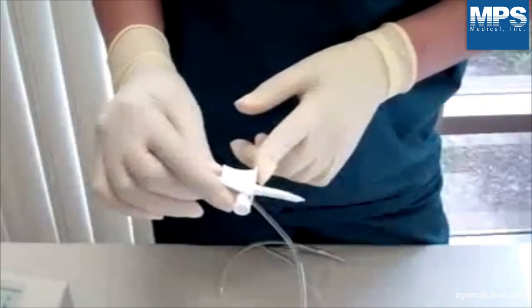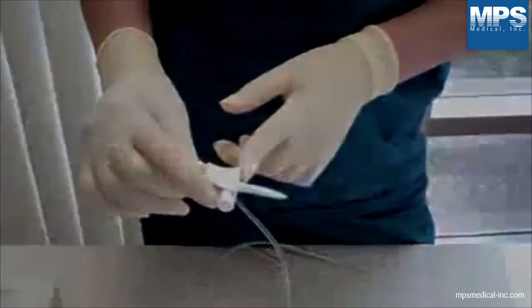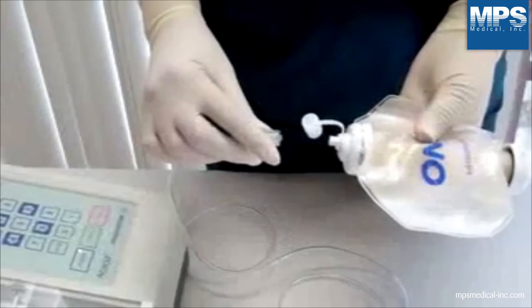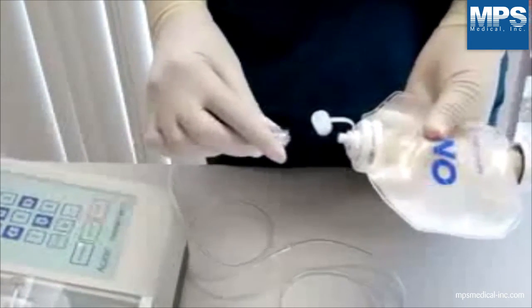Connect the medication source. This may vary depending on how your facility receives medication. Connect the male luer lock to the elastomeric pump and fill by pressing the start function key.